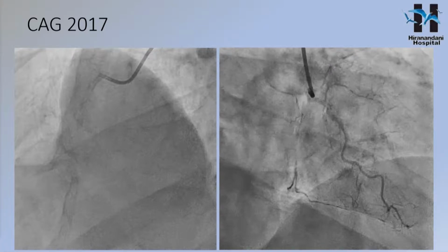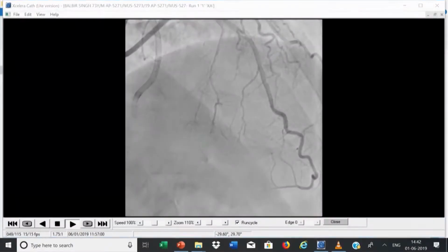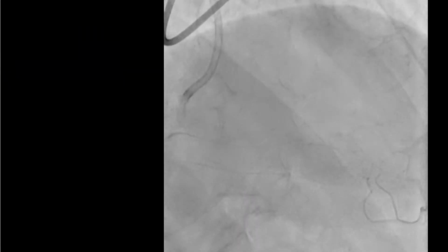Okay, we cannot see the angiogram. Could you change to the angiogram? They cannot see the angiogram. Did you see? Oika-sensei, can you see? No, not yet. No, there are no pictures. No, they cannot see the angiogram. Okay, we can see. Okay.